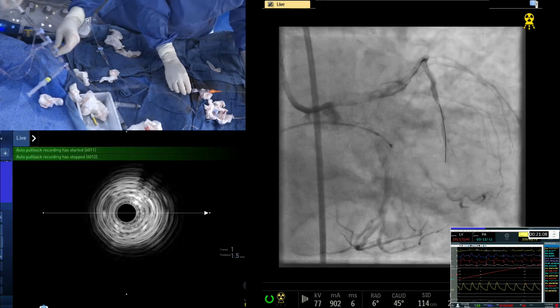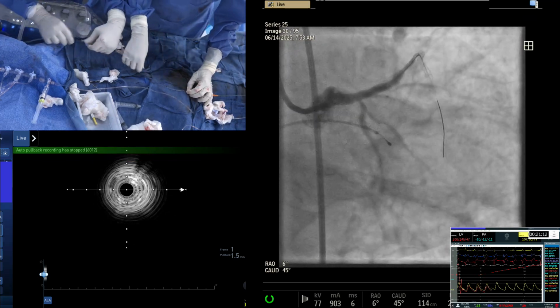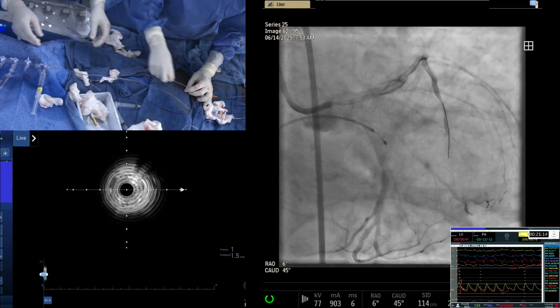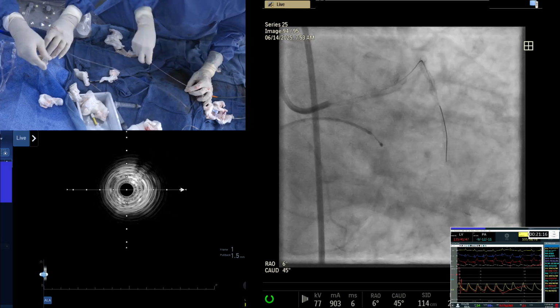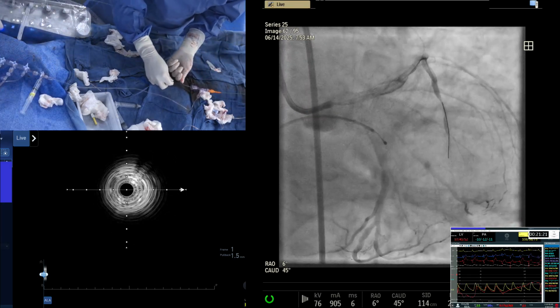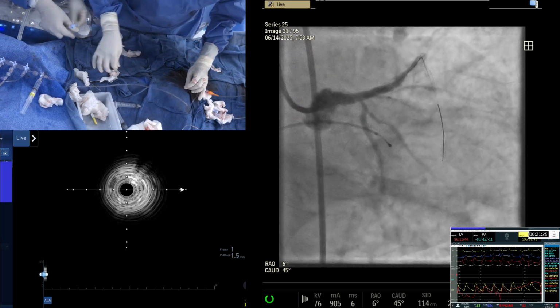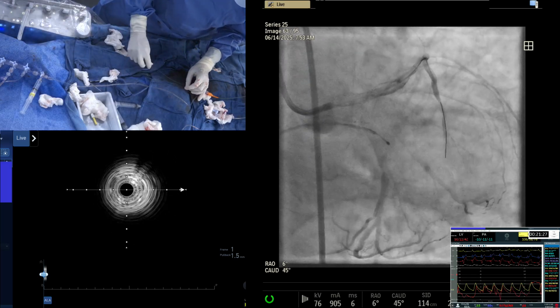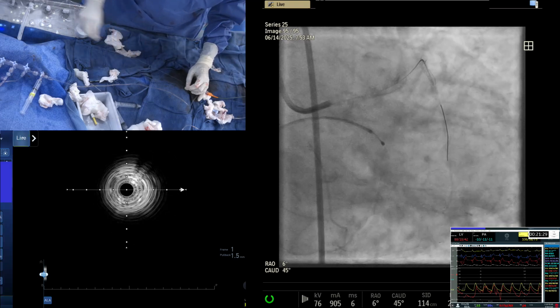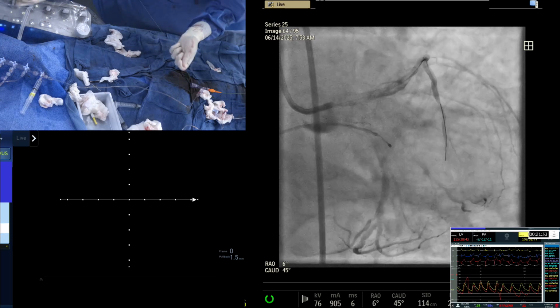Okay. Perfect. Very good. We need a little vasodilator, but do the imaging first. Only issue is, look at the distal LAD. It has no flow because we haven't given the vasodilators, but let's see the proximal one. All the flow will come back there. If necessary, we can do a touch up with the balloon, but I don't think it will be needed. But most important, we want to make sure your proximal left main is good.